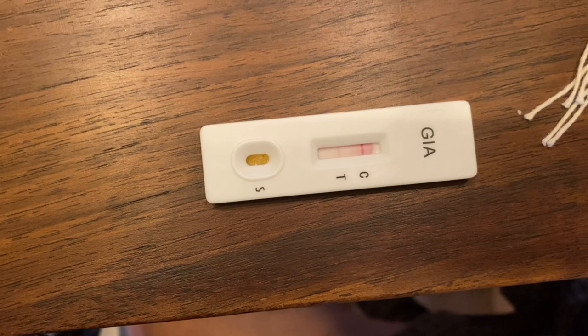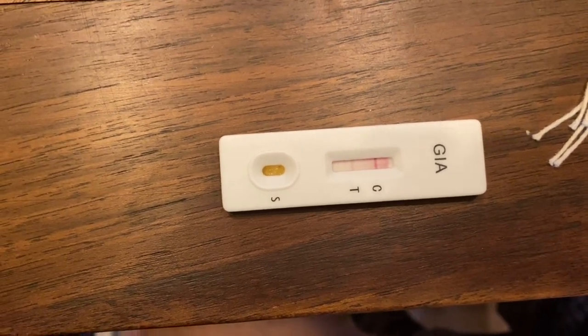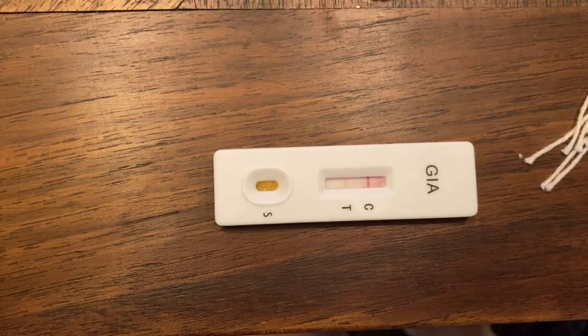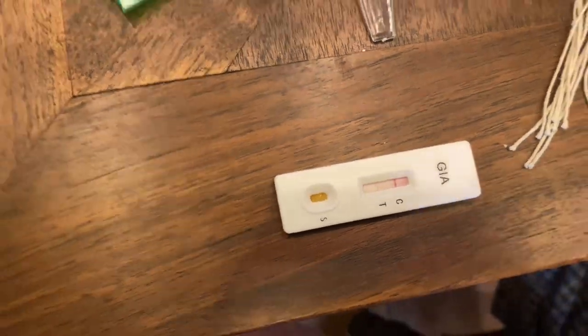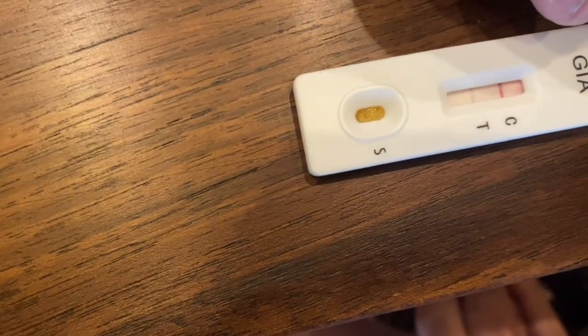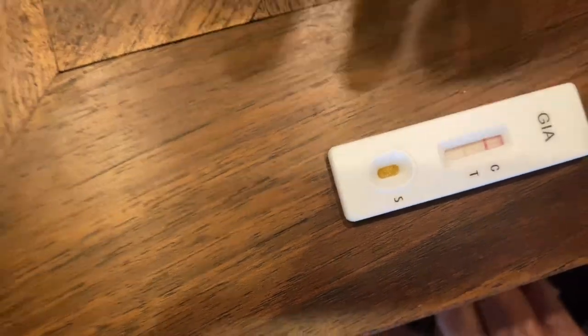He may just be upset because he's been in a new place. Oh — that's actually a positive result! There it is, you can see it right there. That is a positive result. Even if it's very, very faint, it is positive. The C means it's a good test, and the T means it's positive — he's got Giardia. So there we go — absolutely simple.